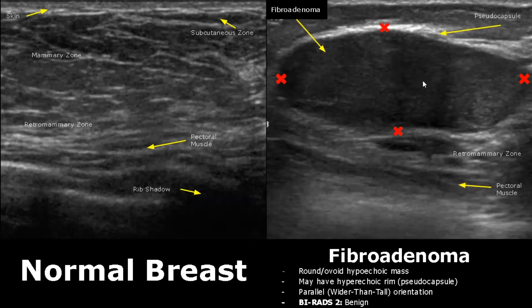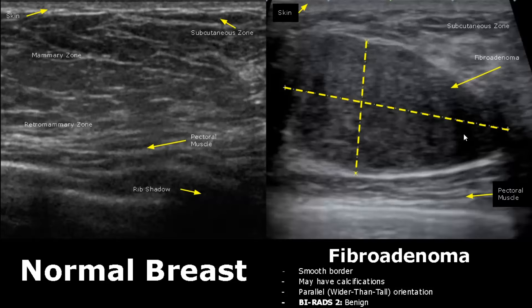Here we have another image of fibroadenoma. It has a smooth border and may have calcifications. You can see the pseudo-capsule here, and it has a parallel orientation — it is wider than tall.